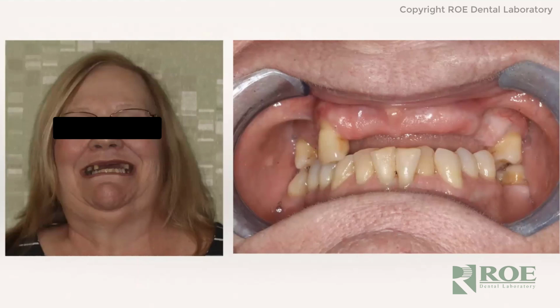We take a look. We have a patient coming in here. She has a nice big smile. On the left-hand side you see her smiling very big, and on the right-hand side you can see the teeth in occlusion. We have to decide, is this a patient that we need to open up? Do we feel good about where the bite is? Do we feel confident that this is going to be acceptable for her in this position?